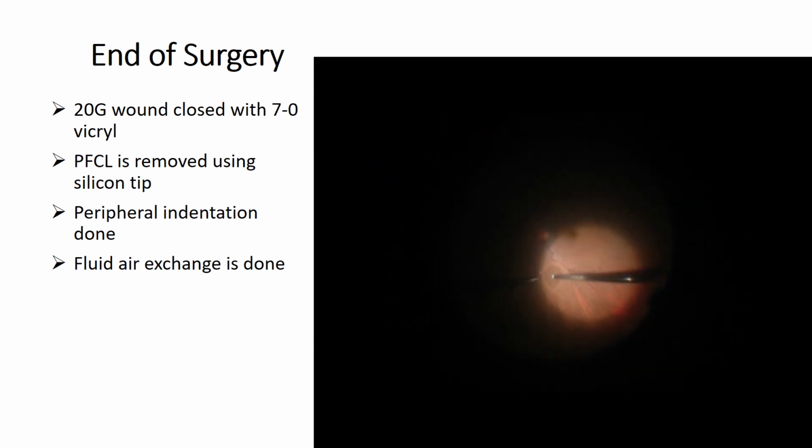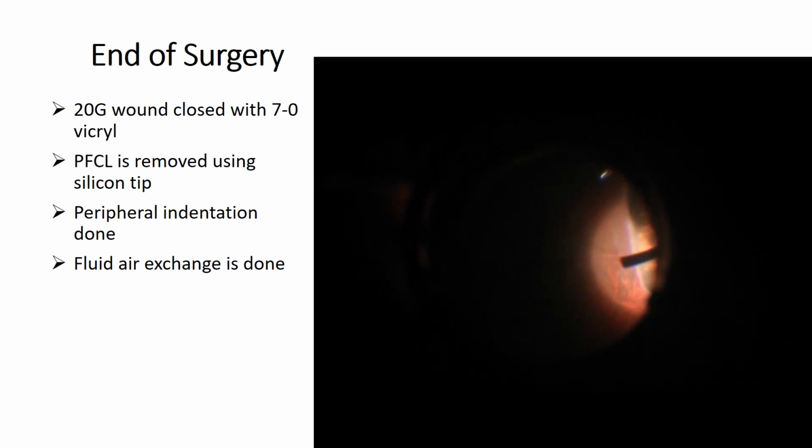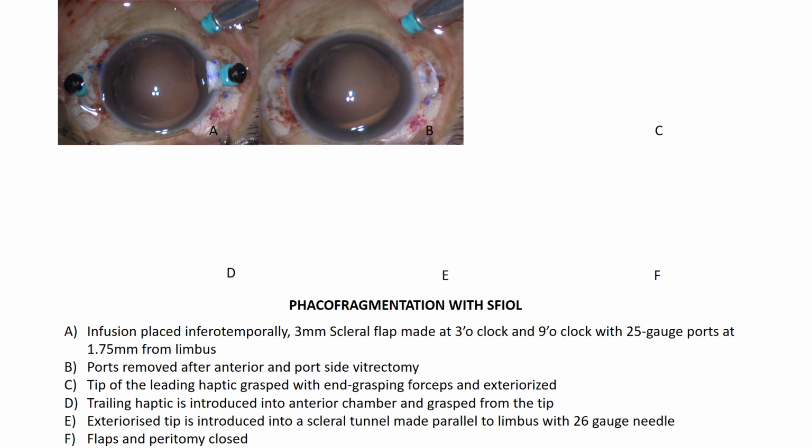After the phaco-fragmentation is complete, the wound is sutured, the PFCL is removed, and peripheral indentation is done to check for any inadvertent or iatrogenic break formation, post which a fluid exchange is done.